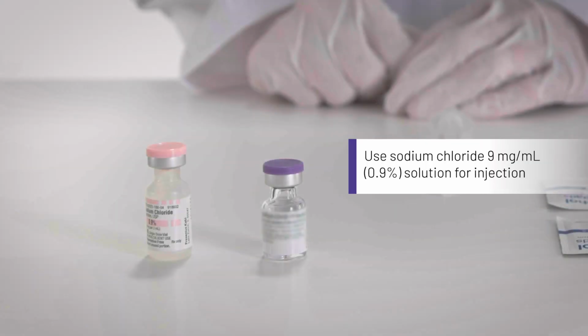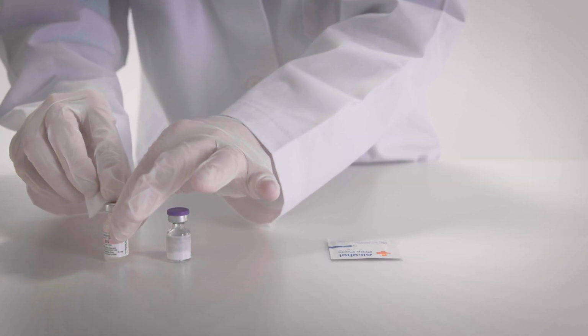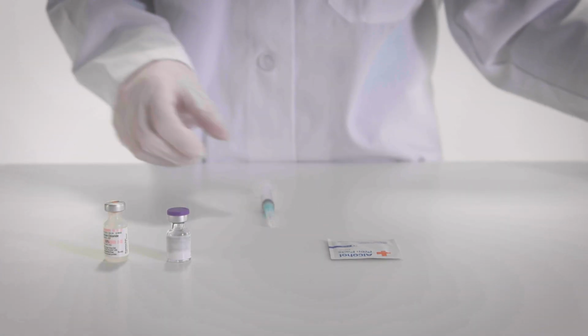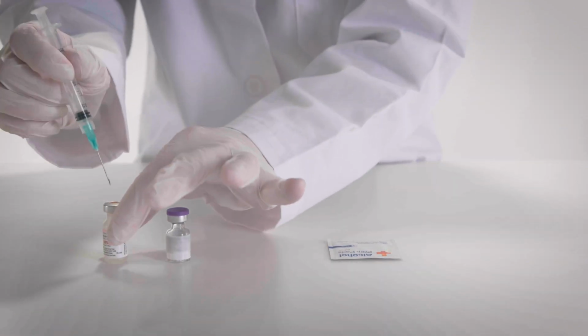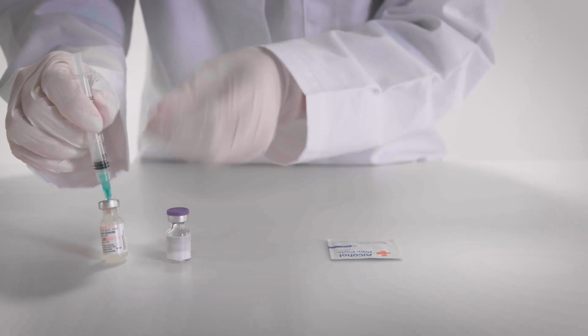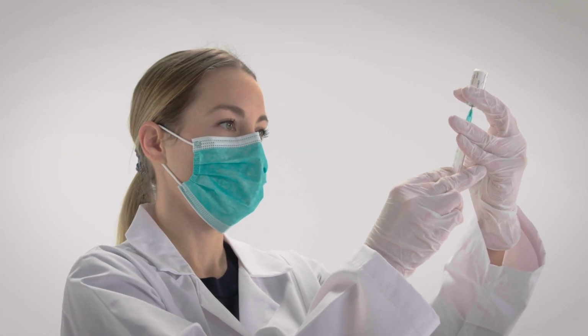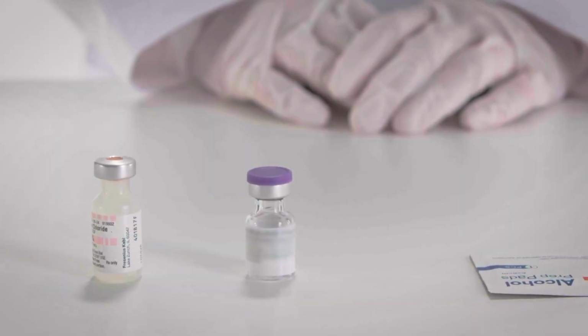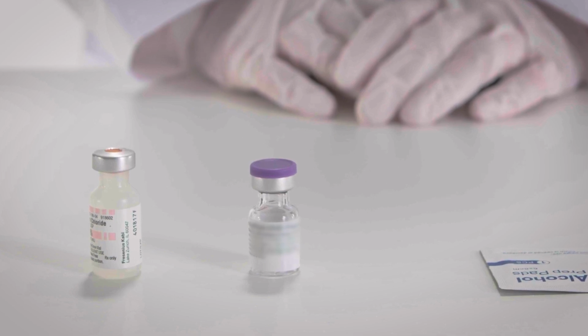Use sodium chloride 9 mg per milliliter 0.9% solution for injection for use as a diluent. Using an alcohol swab, cleanse the vial stopper of the diluent. Draw up 1.8 milliliter of diluent with a syringe with an appropriate graduation and a 21 gauge or narrower needle. Recheck the label prior to use to ensure the correct diluent is used with the vaccine. Do not add more than 1.8 milliliter of diluent.